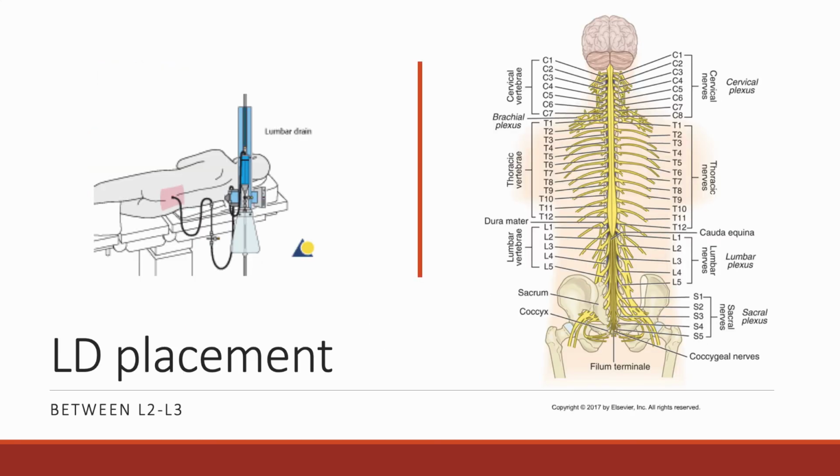And the placement is done like this. They go into the lower back here, and it goes between L2 and L3, and they put the lumbar drain in that method, and that can just be done at the bedside.